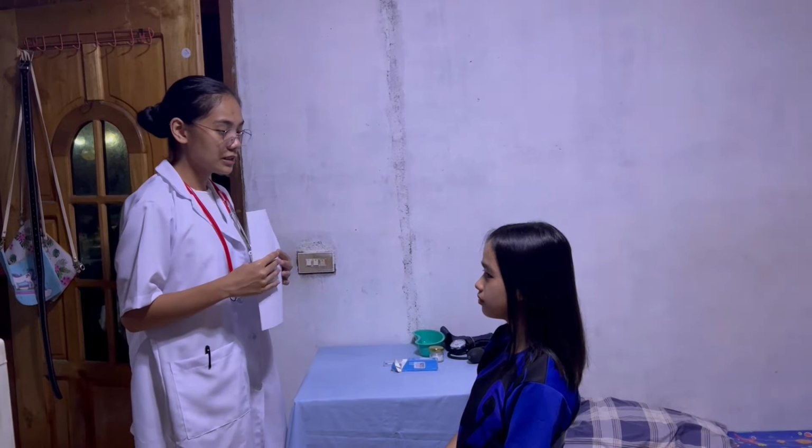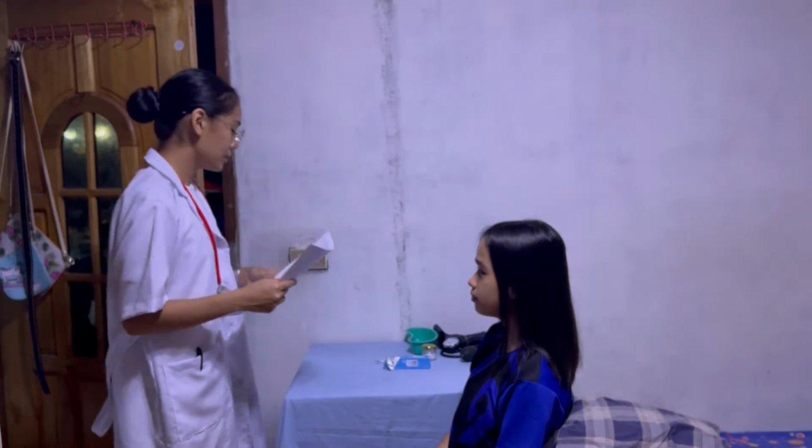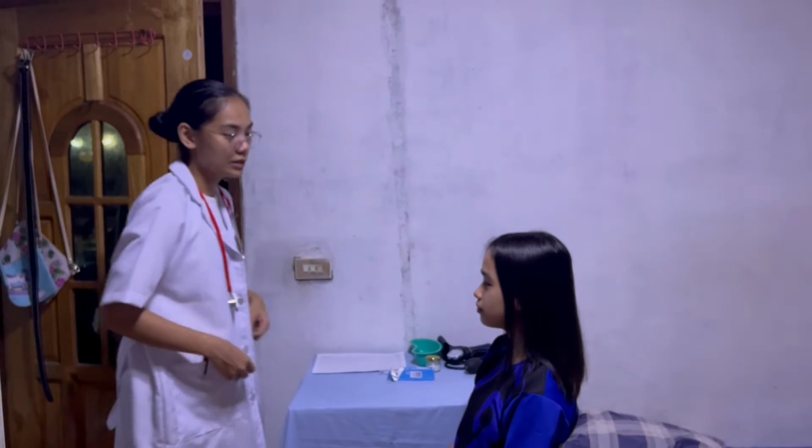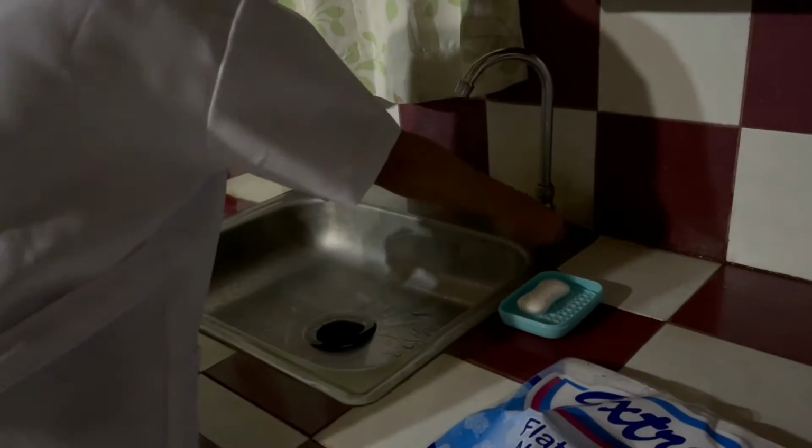Hello, ma'am. I am Zara May Deliza. I am the nurse assigned to you. May I know your name? Karen Delize. Thank you. I will be checking your body temperature, your oral and axillary temperature. Would that be okay? Yes.